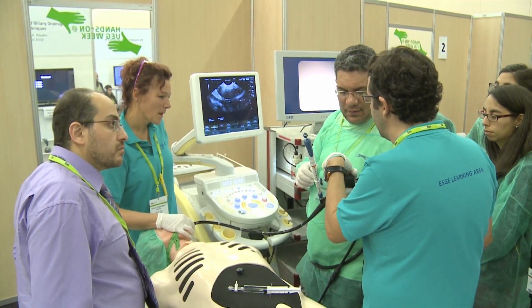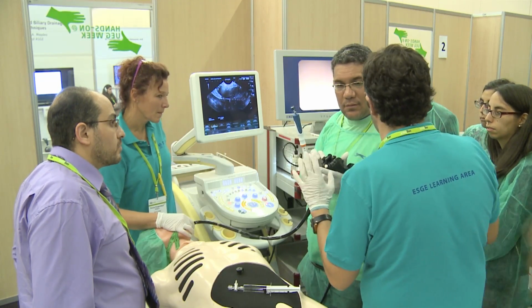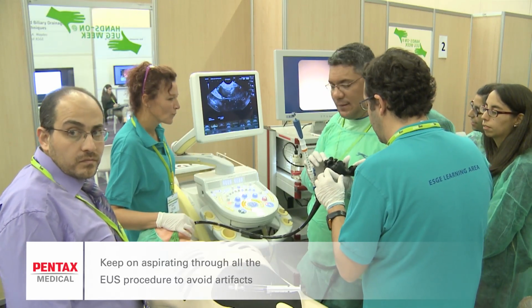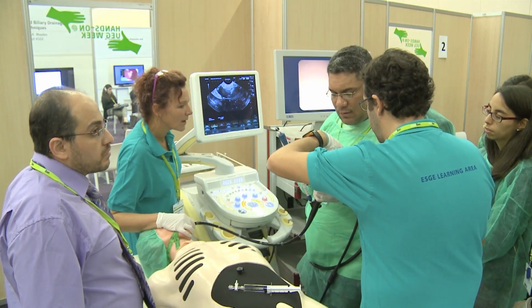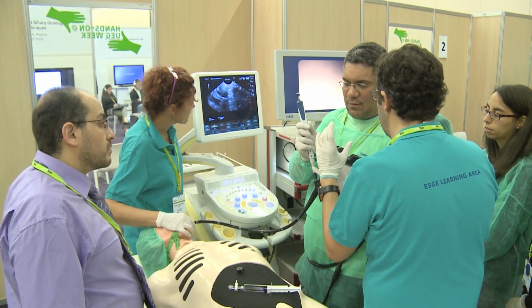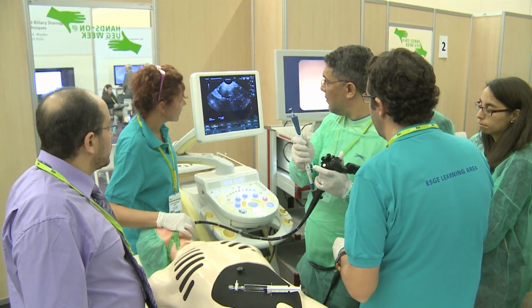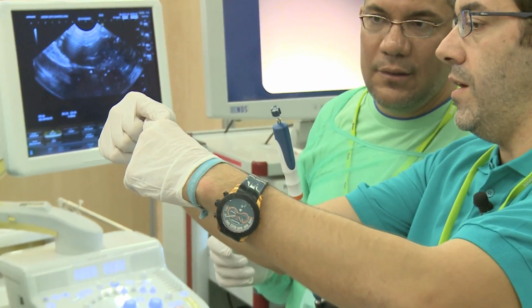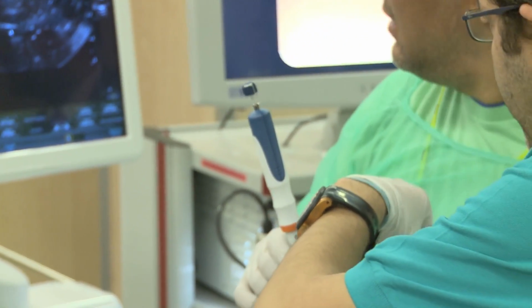Use the elevator up and down, and you see how the needle is always aspirating. This is just the opposite of endoscopy. In endoscopy, you're always insufflating. Here, you're always aspirating. Okay? So you always aspirate continuously. And now, use the elevator. This hand is for the needle. You need to manage everything. But if it goes, look at me. If it goes this way, you need to use the elevator to put it down. So, and now, see.